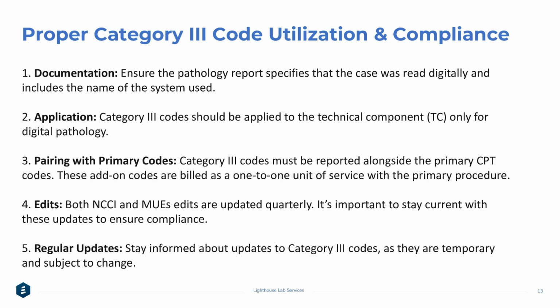With that being said, you also want to make sure the documentation includes the address of the location where the interpreting pathologist read the slides. Also, it's important to note that all slides on a report may not have been read digitally, so we want to ensure that the pathology report format can differentiate between digitized slide analysis and microscopic slide analysis.